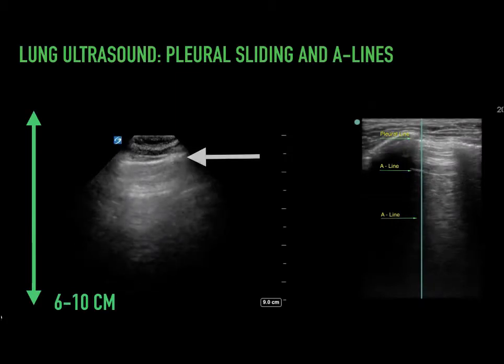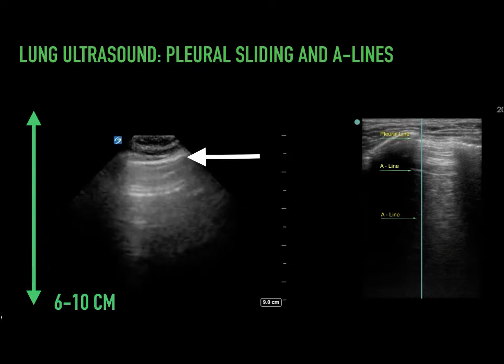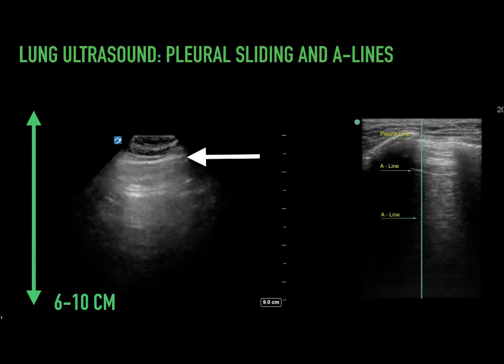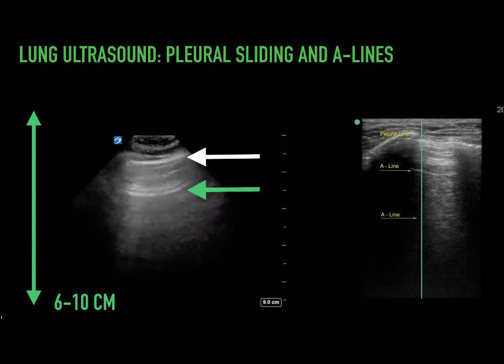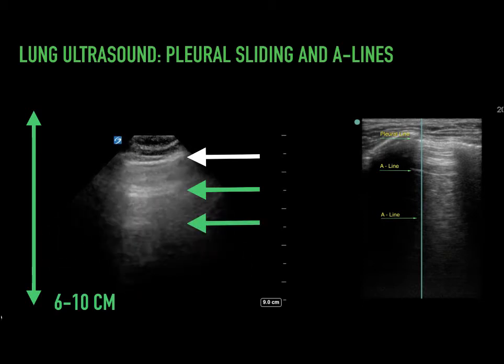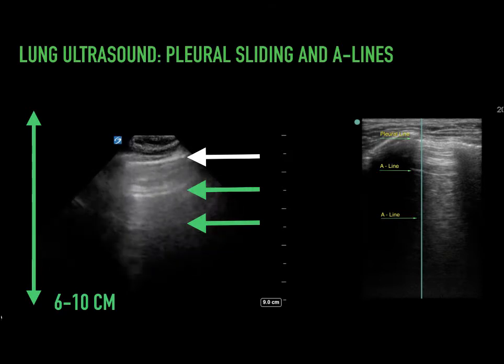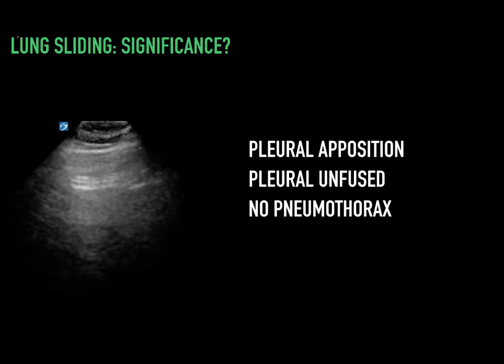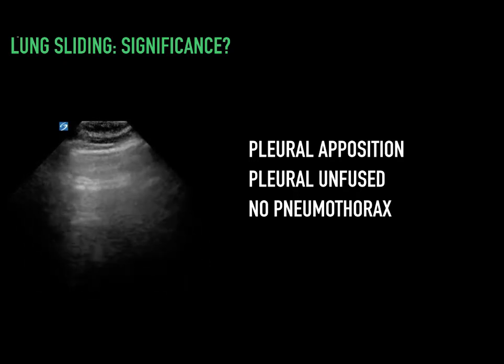In lung ultrasound, we commonly talk about lung sliding. This white arrow is pointing to the area where we see sliding. This means that the parietal and visceral pleura are abutting and they're sliding — you see this scintillating hyperechoic line that goes back and forth. The green arrow is pointing to what's commonly called an A line, a reverberation or duplication artifact of the pleural line to the probe. This is due to a tissue-air interface and reflects normal parenchyma beneath, meaning the pleura is apposed and there's no pneumothorax.